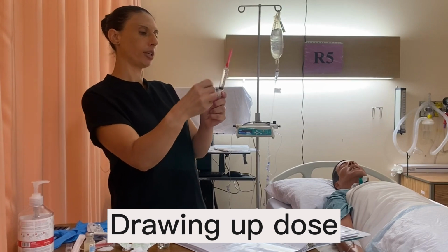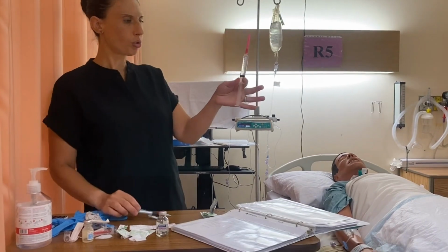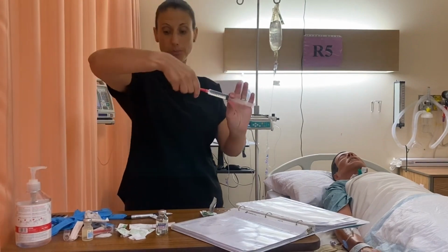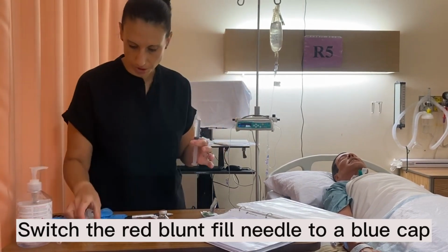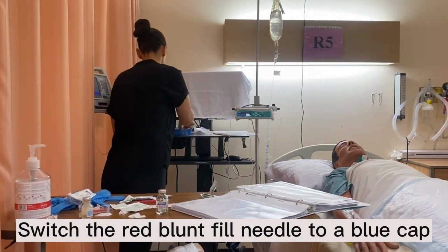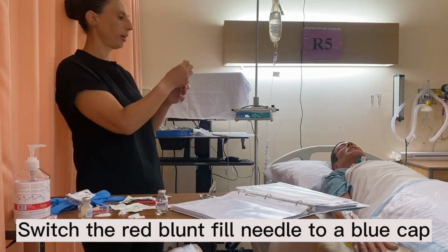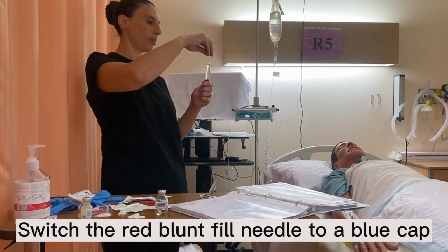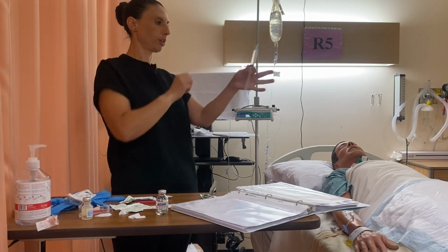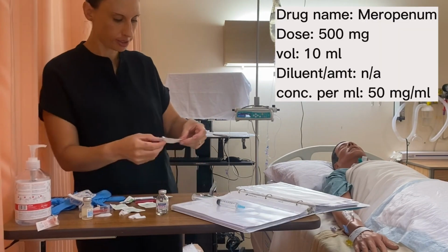Again, we would just wanna make sure we get all of those bubbles out, okay? Because we don't wanna inject that into our patient, okay? And then also too, we don't wanna go to the bedside with this blunt fill needle. So we're gonna take it off and we're gonna put on a blue cap. Okay, so taken from the package, we're gonna sterilely put on a blue cap. Make sure we get all those air bubbles out there. There we go.